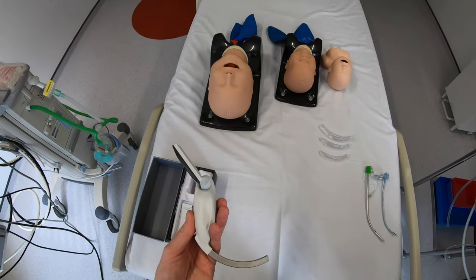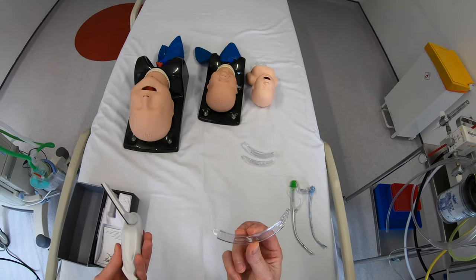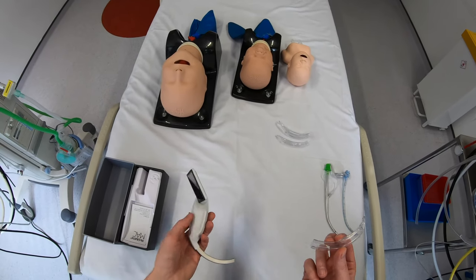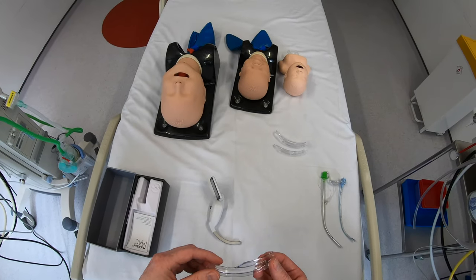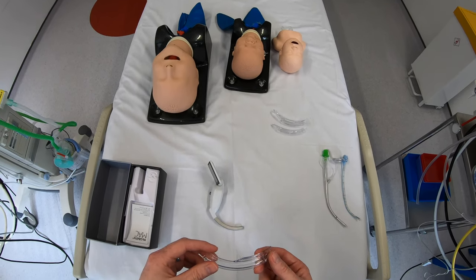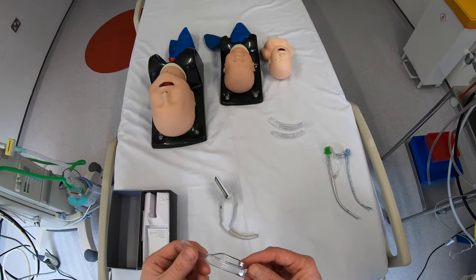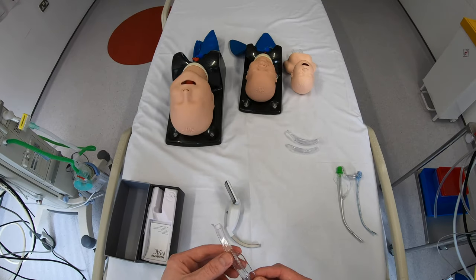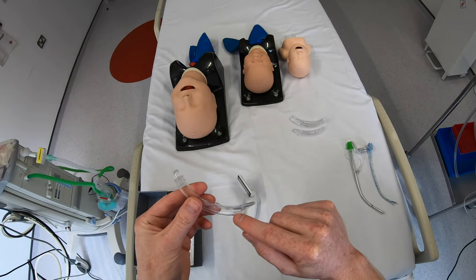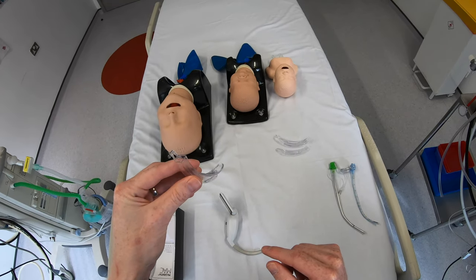It comes with four standard blades: a MAC1, MAC2, MAC3, and MAC4 — this is the MAC1 blade here — and they also have a hyperangulated blade for difficult airways. Coming from other video laryngoscopes, one of the first things I notice is just how thin the blades actually are. In this plane they're quite narrow, which is going to be great for getting into children with limited mouth opening and for angling round corners.